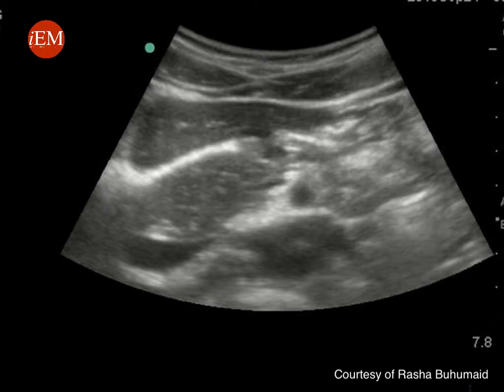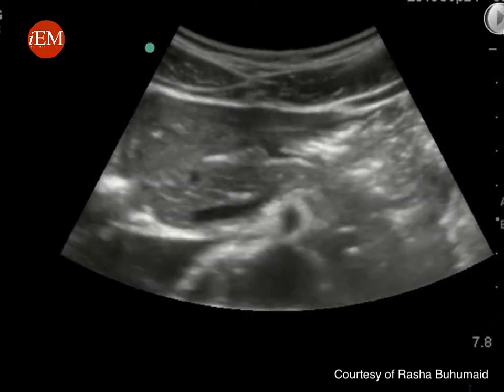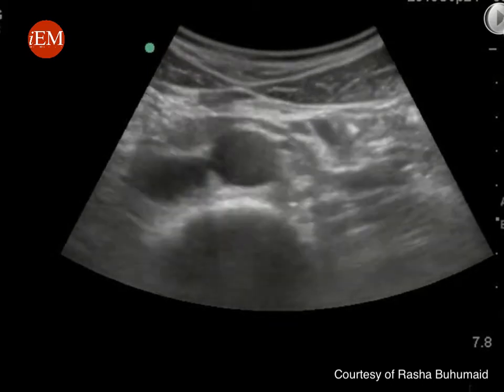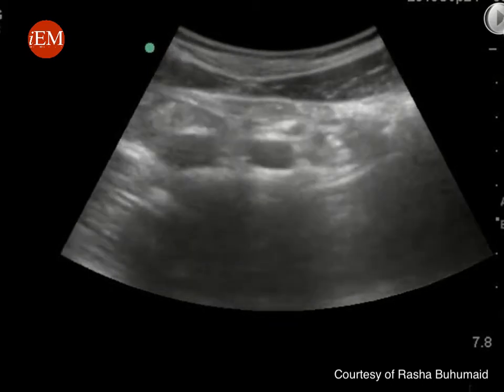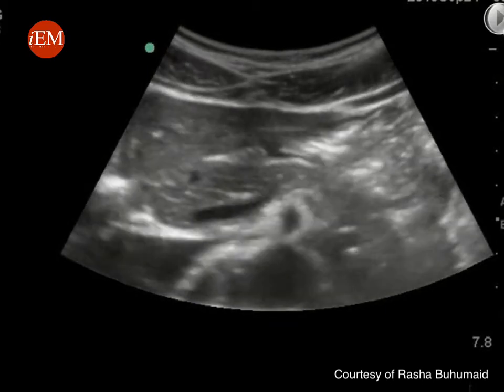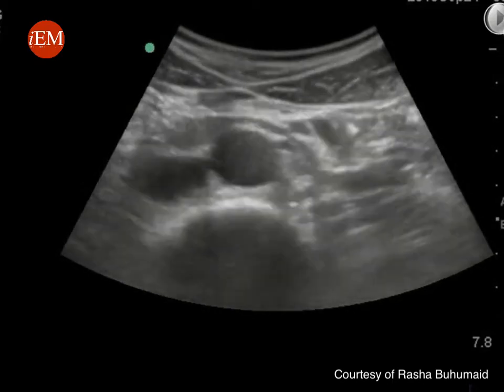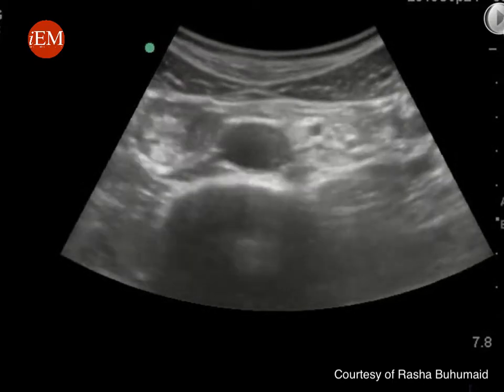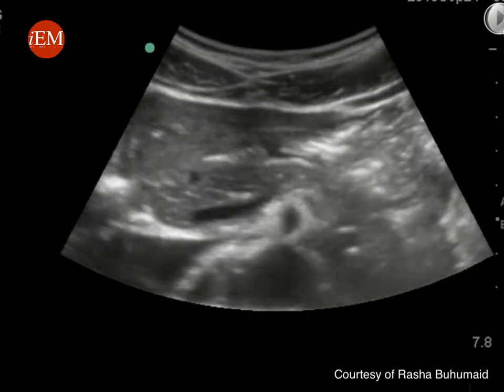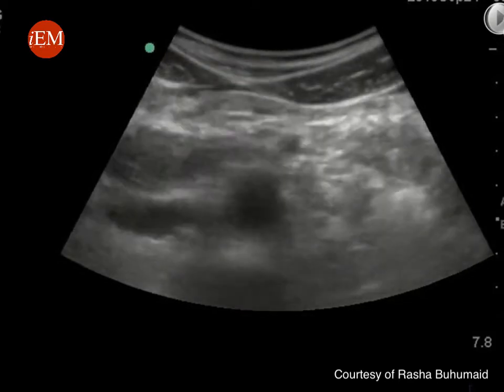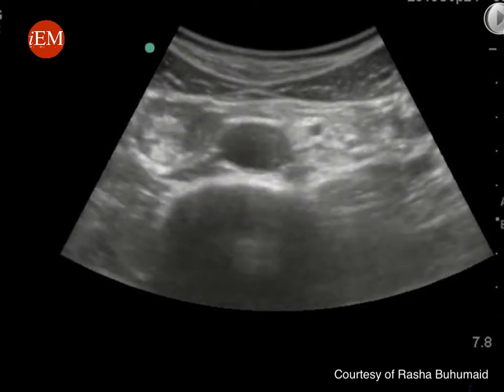It is very important that you visualize the whole abdominal aorta to be able to rule out abdominal aortic aneurysm. In this video you will see the scan starting at approximately the level of the SMA and continuing until the bifurcation into the common iliac arteries.